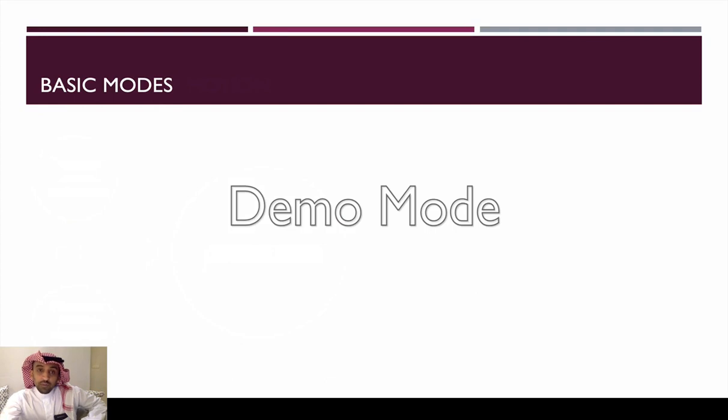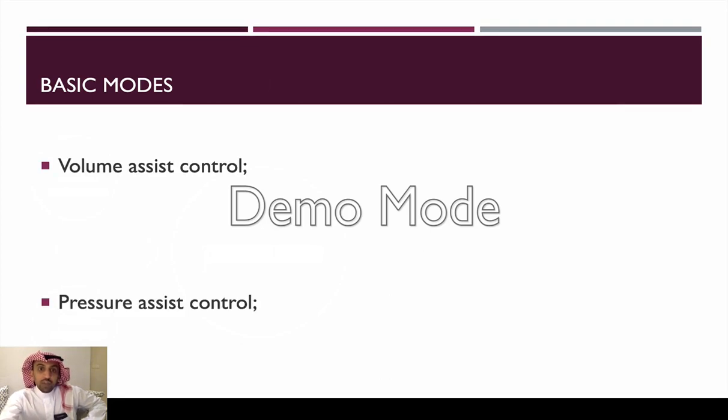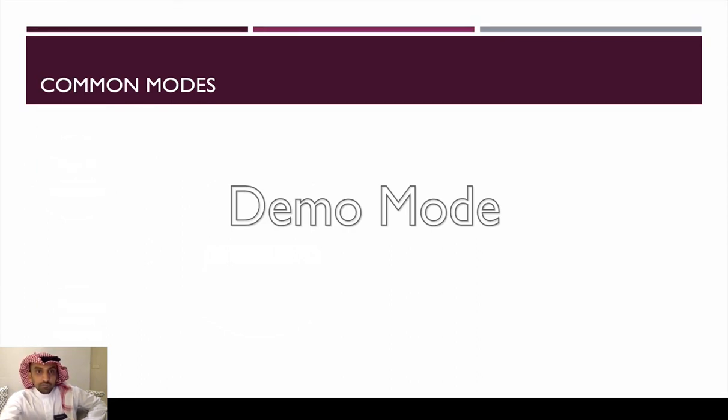The basic modes of mechanical ventilation that we will speak about specifically for COVID-19: you can have a volume assist control mode or a pressure assist control mode, and I will be talking briefly about both of them.